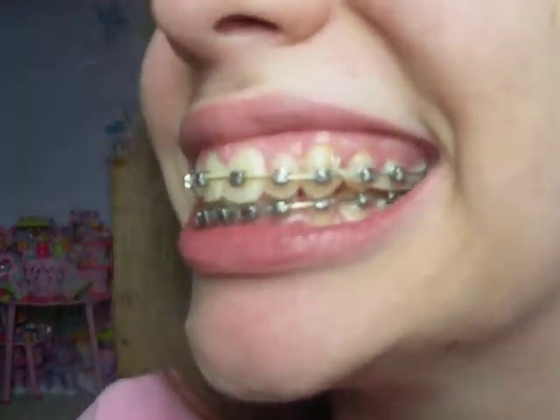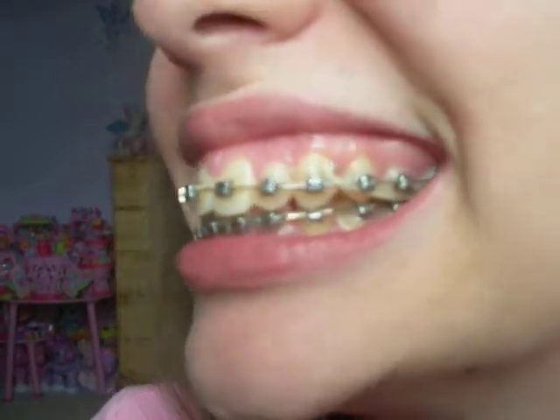I think I told you in my last vlog, the orthodontist is trying to pull back the top front teeth as far as possible, using the elastics that I have to have from the hooks at the back to the hooks at the front. We're trying to tuck the teeth back as much as possible. We know we're not going to get a perfect result because of my overbite, but that was explained to me at the start, and I'm perfectly happy with that, because I didn't want to go through with the jaw surgery. So we're just trying to get the most perfect result we can with the braces. But you can see, if I give you a profile shot, the teeth have been brought back a long way now, if you compare to my original videos.